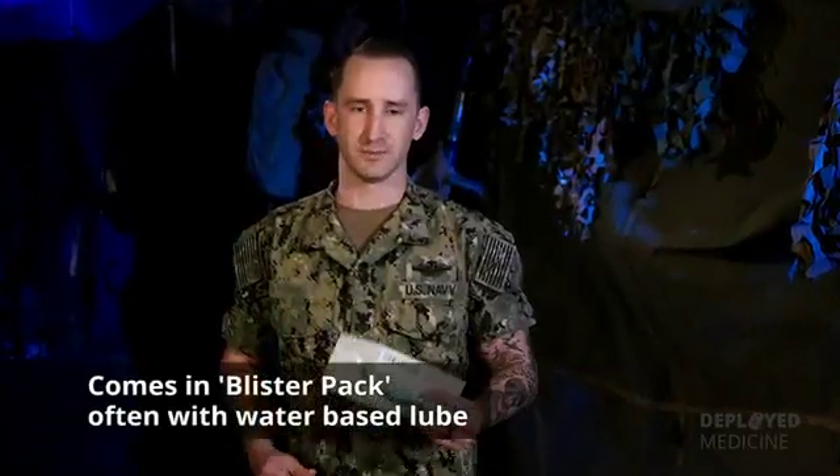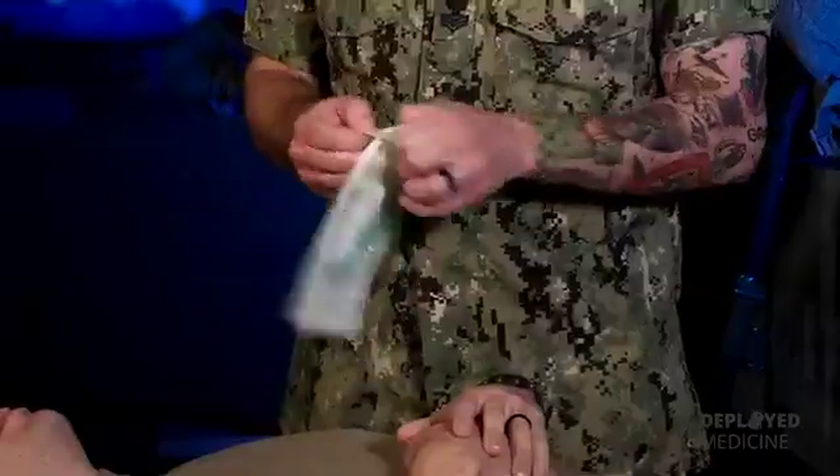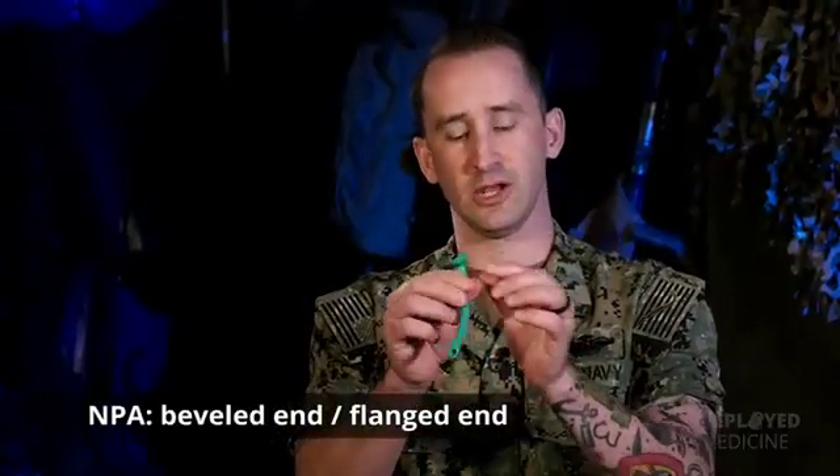The nasopharyngeal airway typically comes in a blister pack ready to use and often comes with its own water-based lubricant. The NPA has two parts: the beveled end and the flanged end.